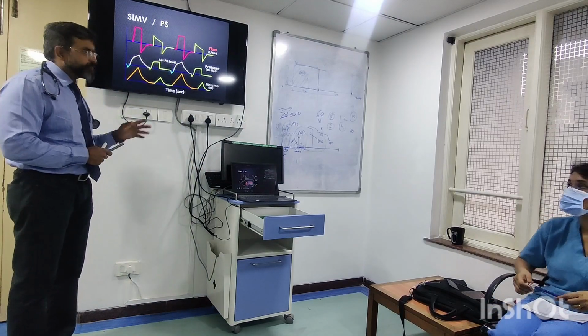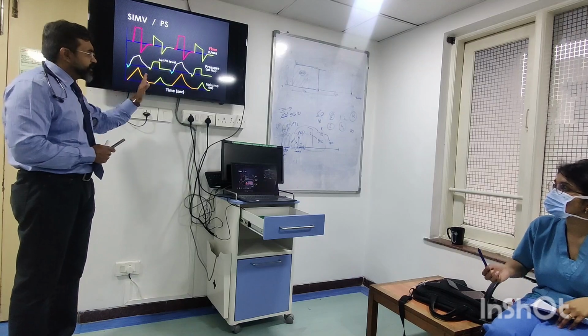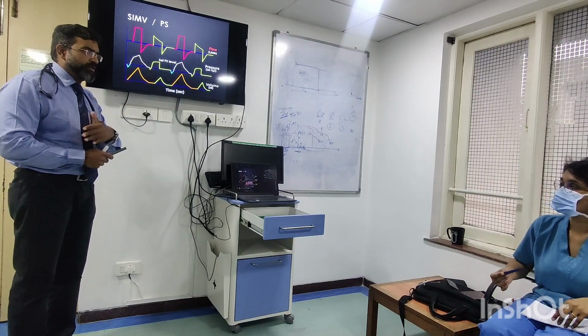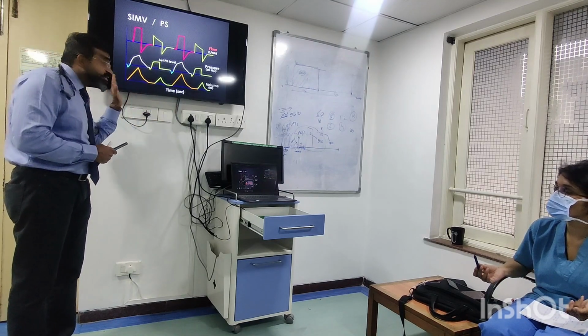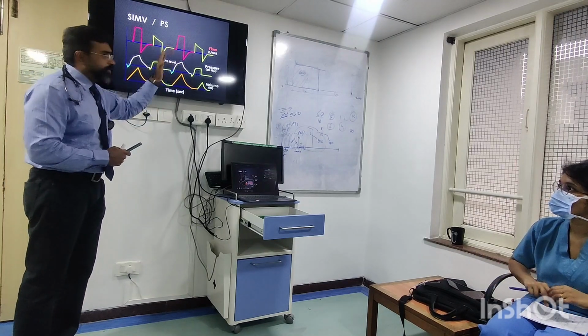Two types of breathing. Spontaneous. So what kind of breathing is it? When you talk about what kind of mode is going on, think trigger, limit, cycle, variable. So this is patient triggered. There are two breath types. One is this breath type, the other is this breath type.